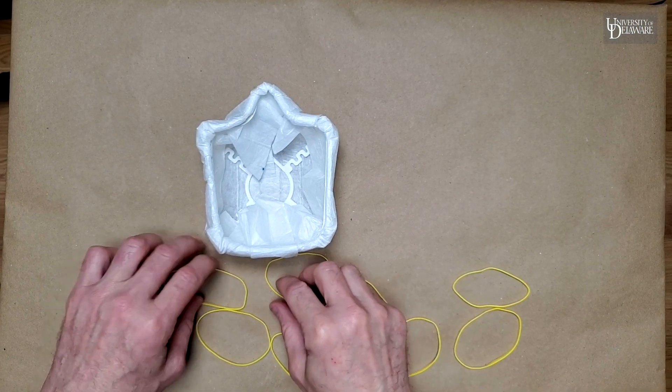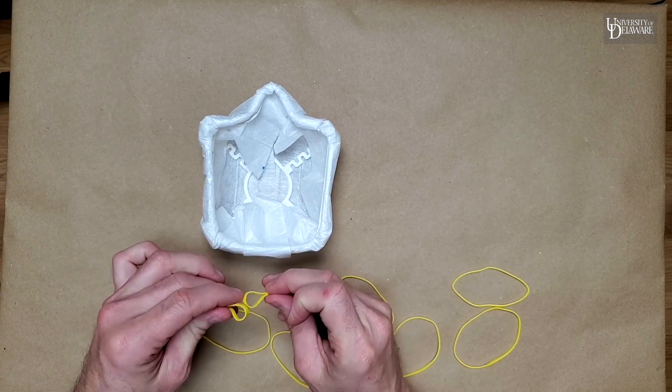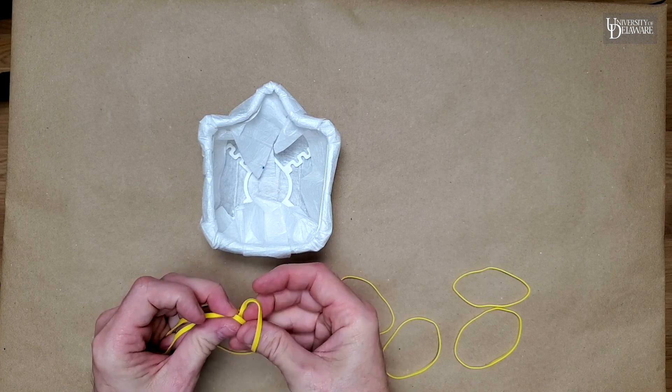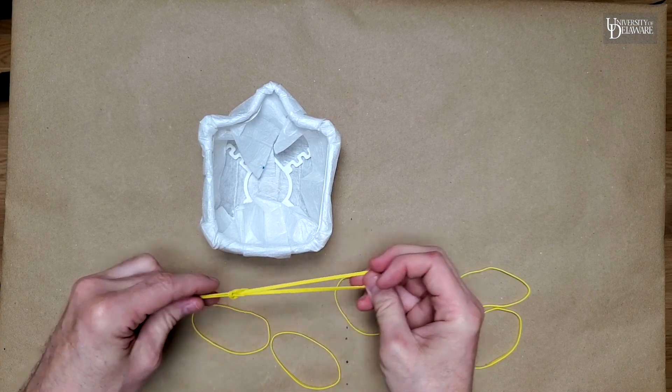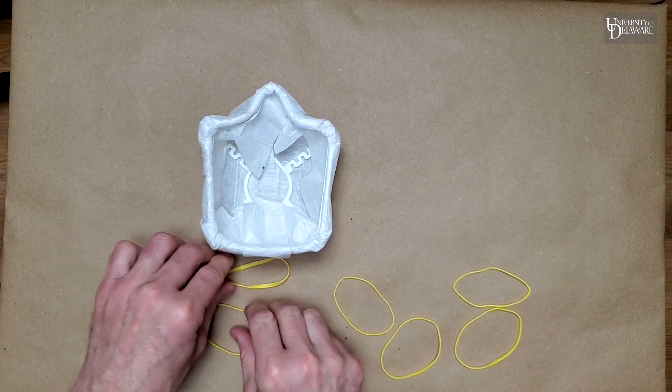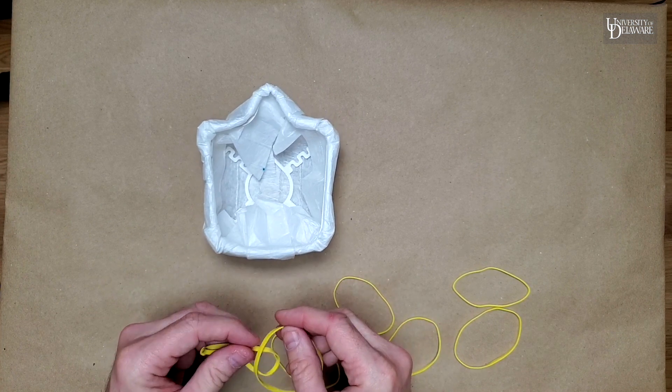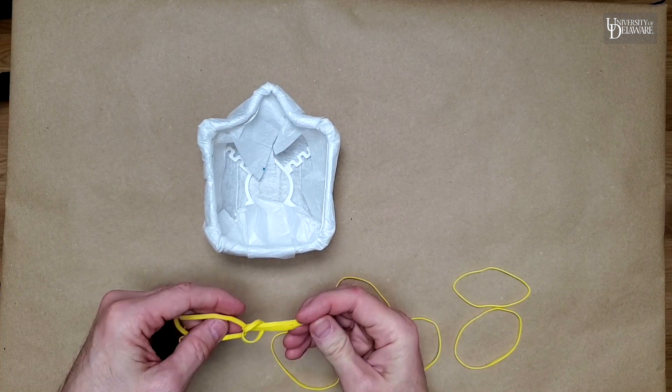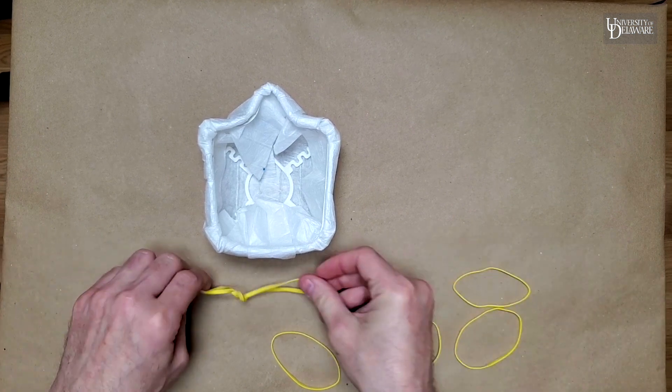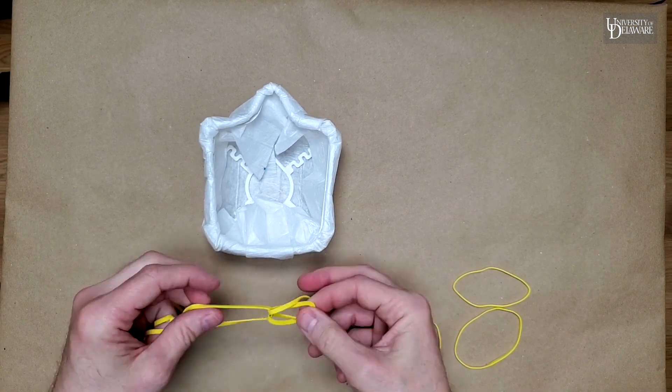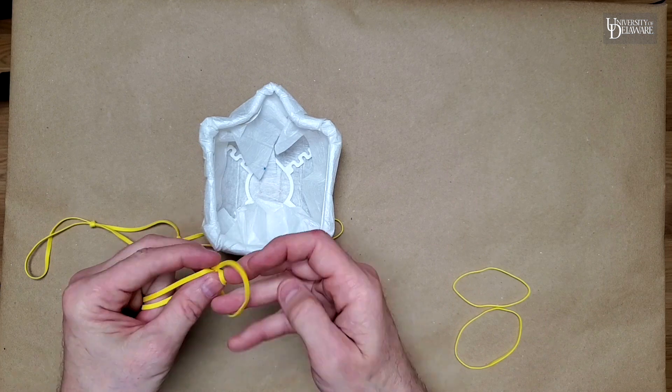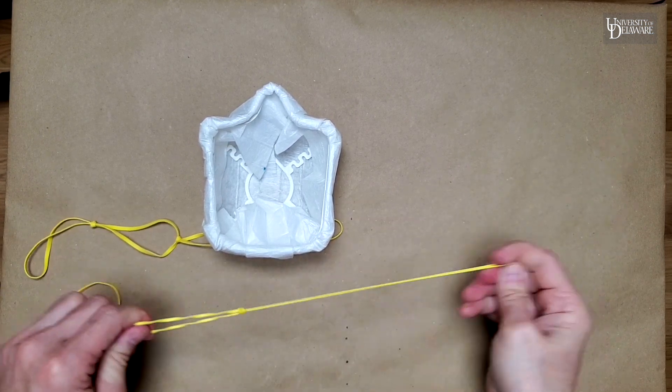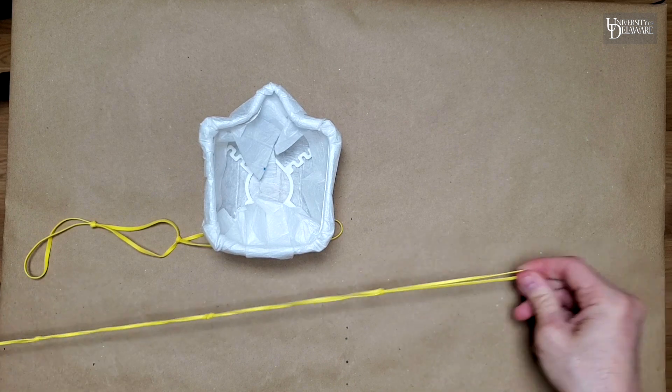Now this is an option that if you don't have the buttonhole elastic, which we have on order, this is a way to do it in a pinch. And all I'm doing is looping four bands together. There we have our two straps.